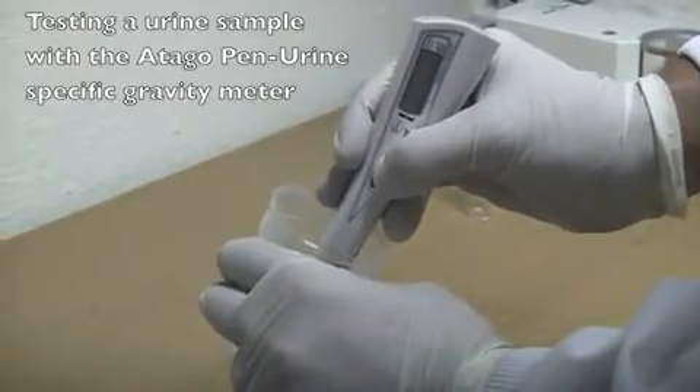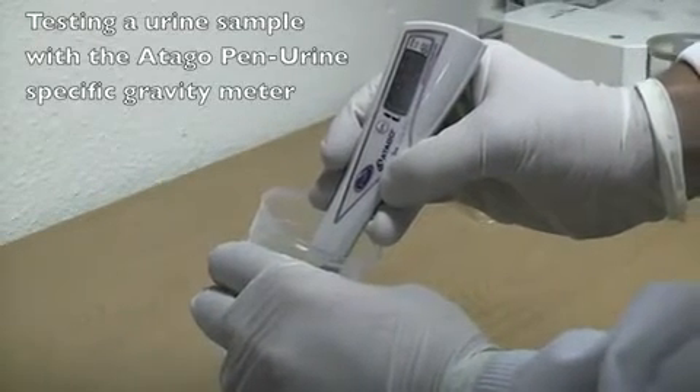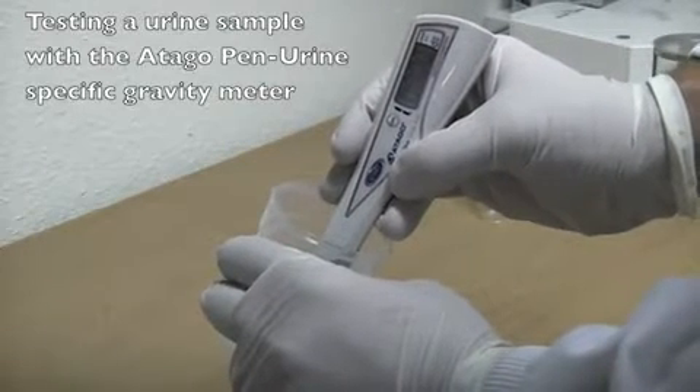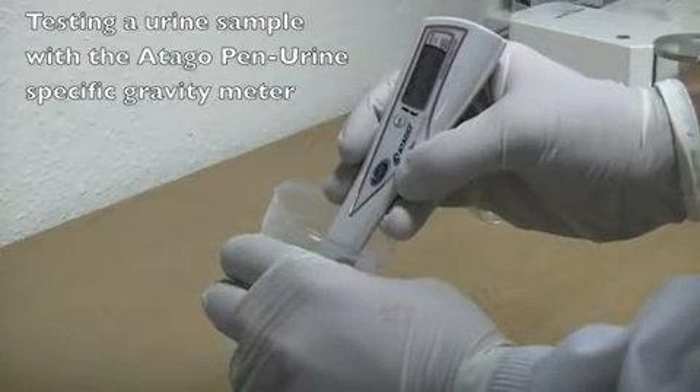The probe is now placed in distilled water. The user presses start to zeroize the instrument. The value expressed is for water being 1.000.